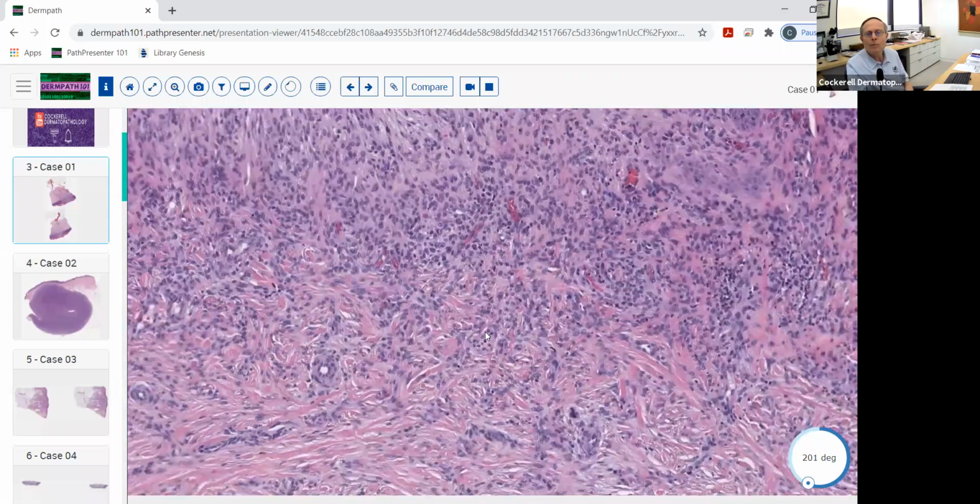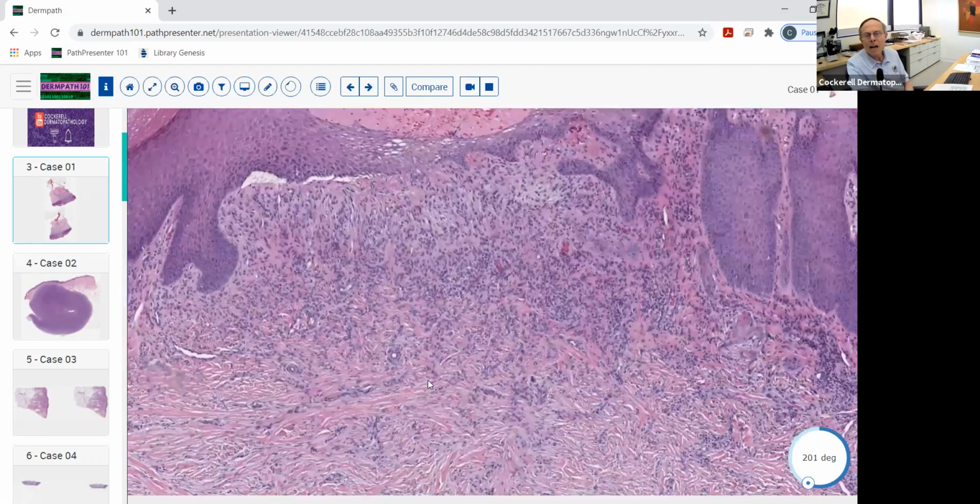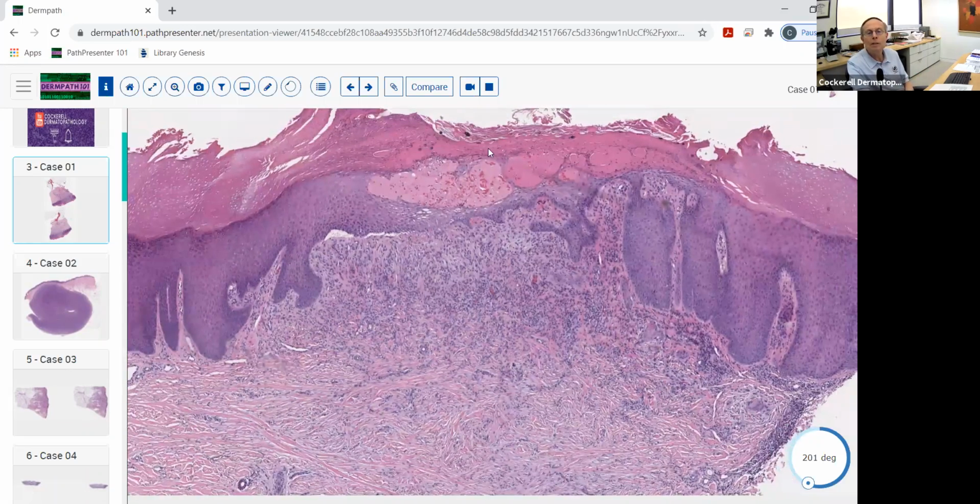And there are a lot of different variants of dermatofibroma. There's probably about 6 or 7 variations on the theme that you need to know about. This is kind of the classic common type. This could have been precipitated by trauma, maybe a bug bite, and you get a secondary dermatofibroma that develops, maybe a ruptured hair follicle, something like that. Pretty common post-traumatic injury. You can see there's some crust up here. So this might have been precipitated by a bite.